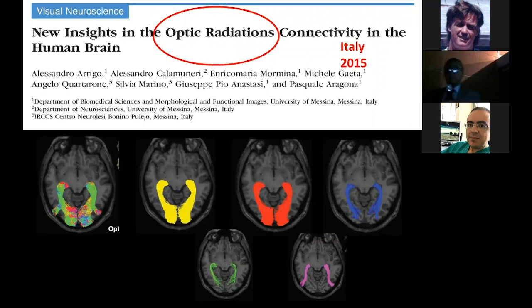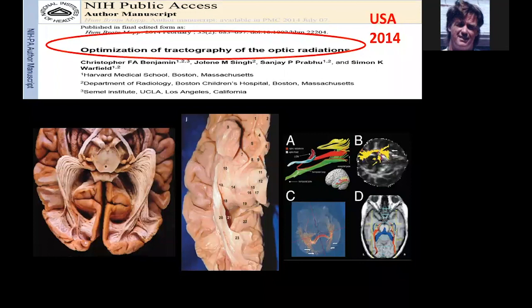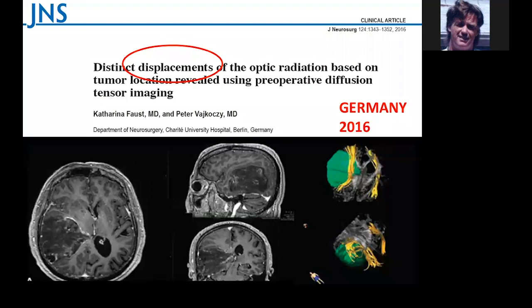So this is a very beautiful bit about the optic radiations from Italy, how the optic radiation would look in various subjects and various patients. Of course, this is a tractography. Again, optic nerve, tract, chiasm, tract, coming to the lateral geniculate body, giving the temporal lobe, and then going around to the occipital area. So here you are, temporal, Meyer's loop, temporal, same thing here. Why am I mentioning this? Because it has very much relation to the surgery you will see. So this optic radiation will be displaced by various tumors. This is an intrinsic brain tumor. Because it is intrinsic, it would push the optic radiation, which is here, medially, like this.